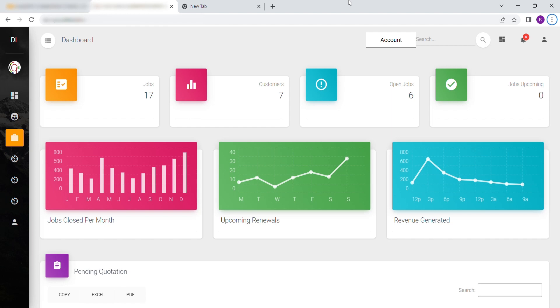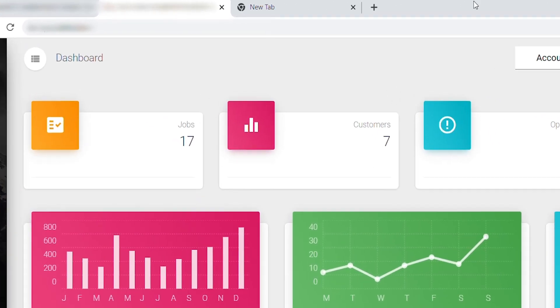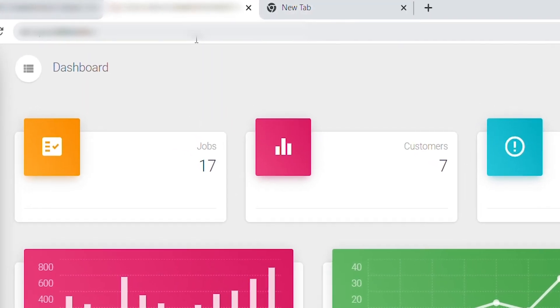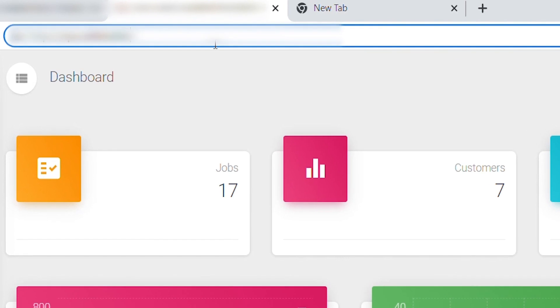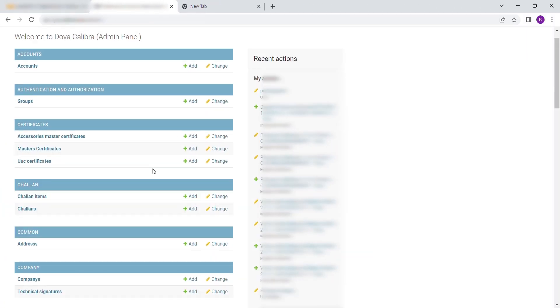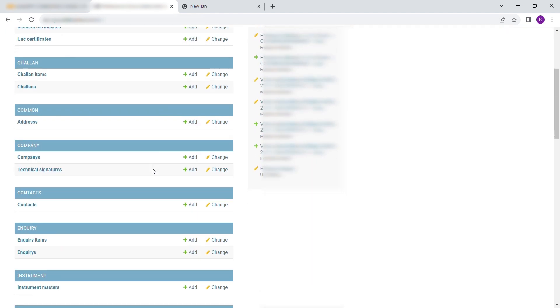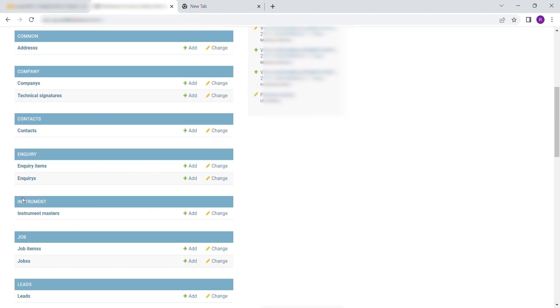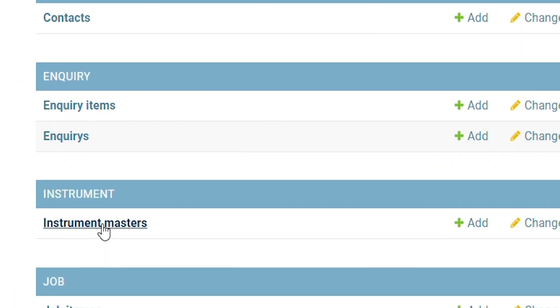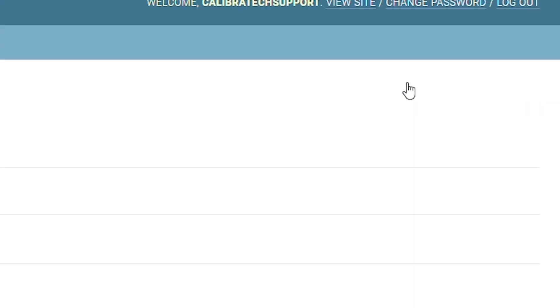To begin, you will need to head over to your admin panel by entering the URL. To enter Instrument Master, scroll down to Instrument. Select Instrument Masters. Then click on Add Instrument Master.